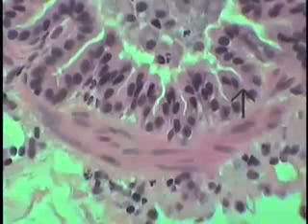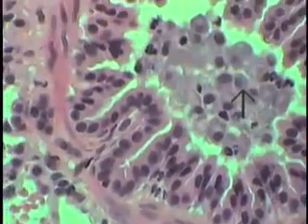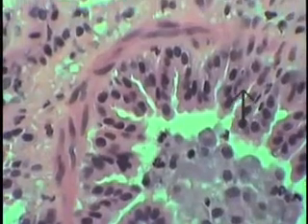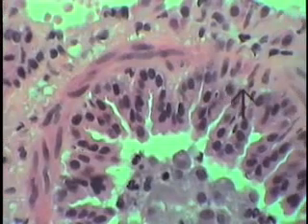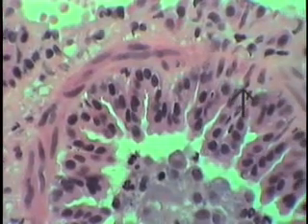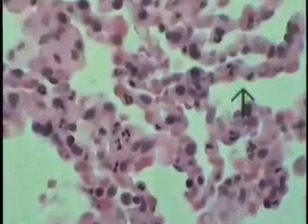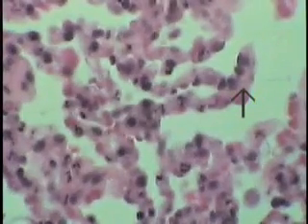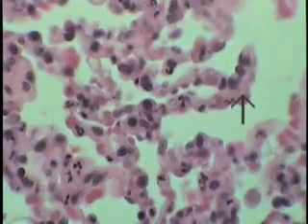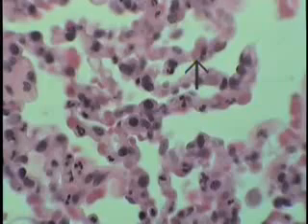So this is a typical portion of a bronchiole and its characteristic features. The supporting wall only of smooth muscle and this folded nature to the epithelium. The surrounding structures, as seen now in the field of view, are collapsed alveolar walls. So these are the alveoli, these spaces out here, they're alveolar walls as indicated by the pointer.